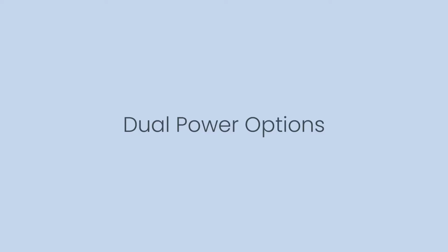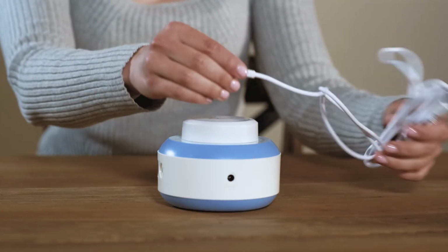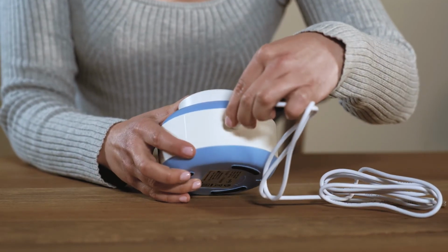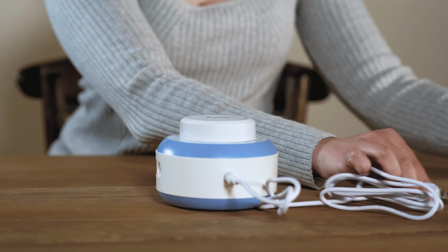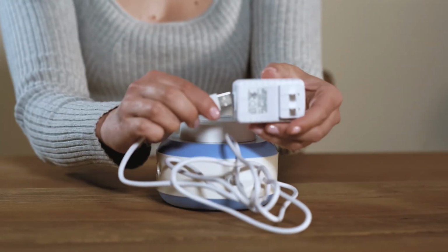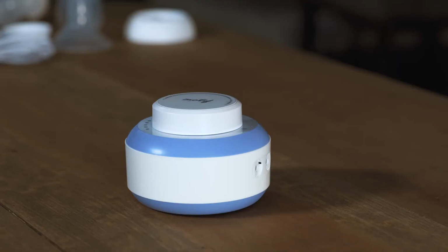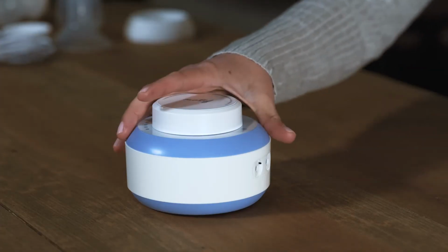Dual power options. If using the Motif Twist on stationary power, insert the power adapter into the DC port on the pump. Then insert the USB into the USB socket adapter and plug into a power outlet. If using the Motif Twist on battery power, be sure to properly install the batteries into the pump.